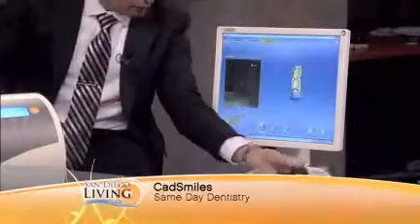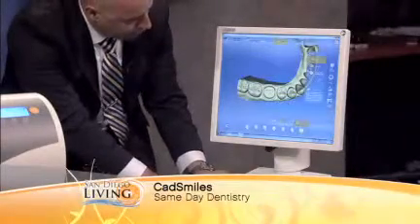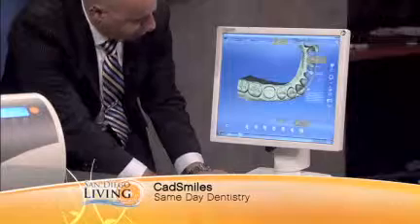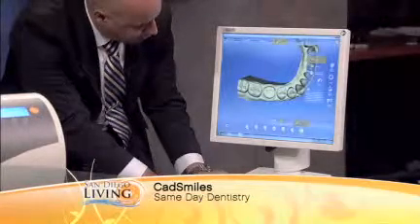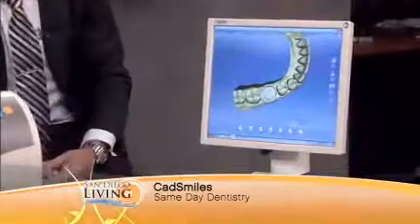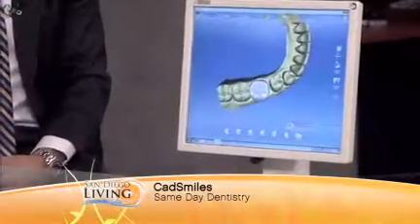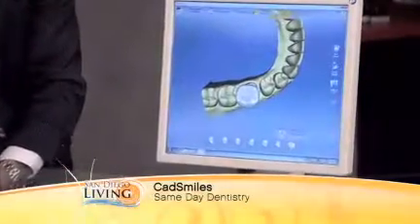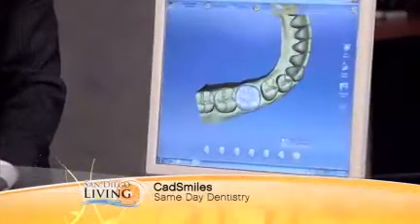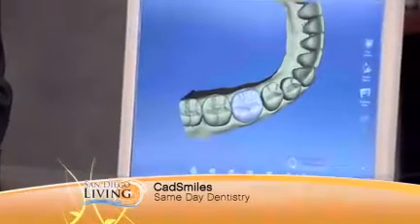And then once that's done, and imagine that if there was a rubber impression, this would take a long time. Right now the impression has been taken. We can come here forward and tell the software where the finish line of the tooth is. And then it does a little dance here, and the software actually places the tooth where it's supposed to be. And it actually creates a model not only of the mouth as it exists, but then designs the tooth, the veneer that's going to go on there? Right. Now, is this a veneer or a crown? This will be a crown.